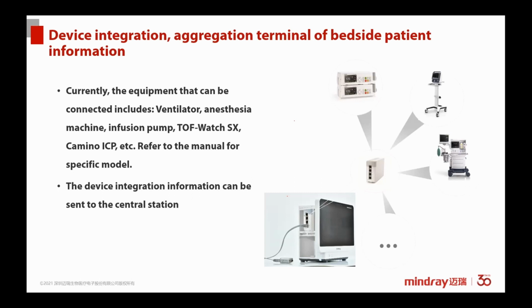The monitor can view the parameters, waveforms, and even some parameter settings of the integrated device can be changed. The information coverage reflects the patient's current vital signs, and it will be sent to the CMS or even the hospital information system synchronously.